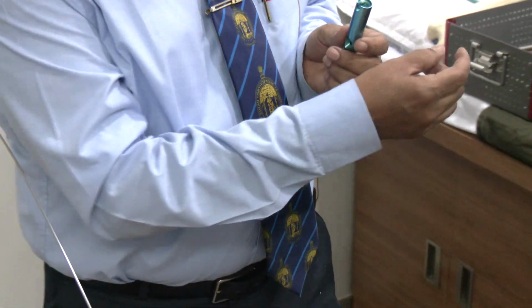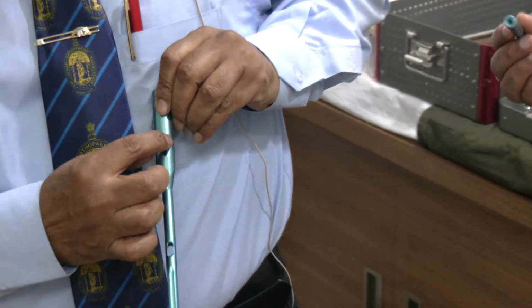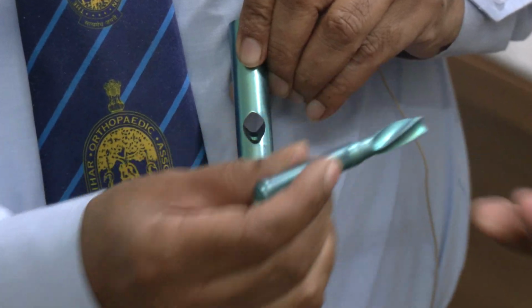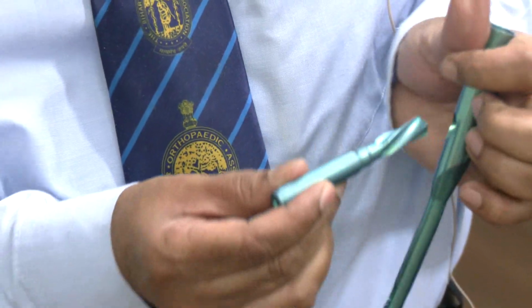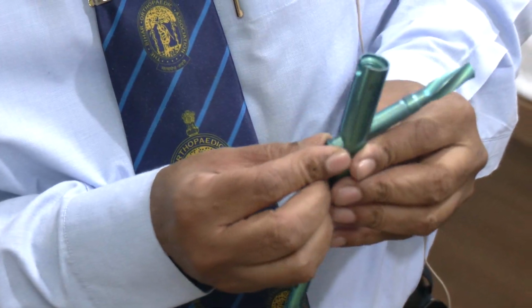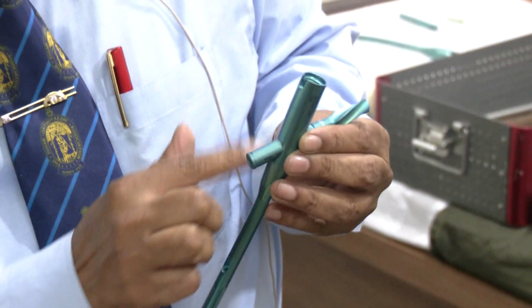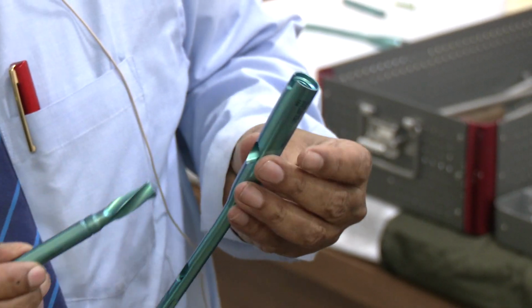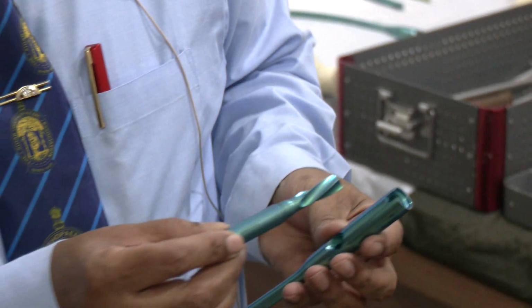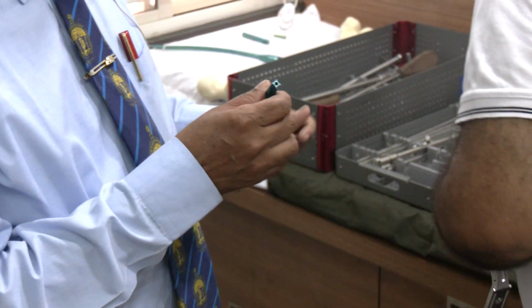So the helical blade, if you look at the hole, you can see this is not round. So this helical blade also has a sort of rotation which will not happen. It is vertically larger in diameter than horizontally. So that is the advantage of this instrument. And the helical blade part I will show right now, the screwdriver, how to open up.